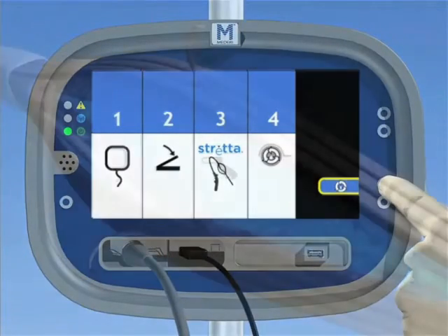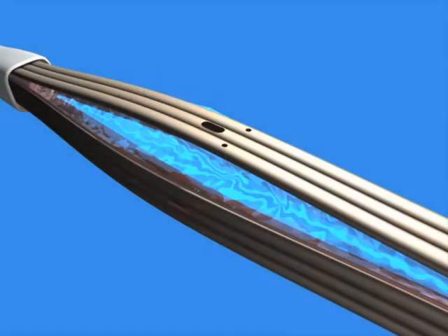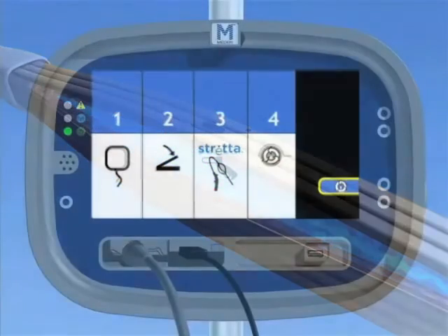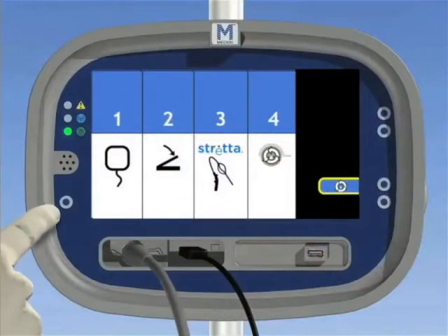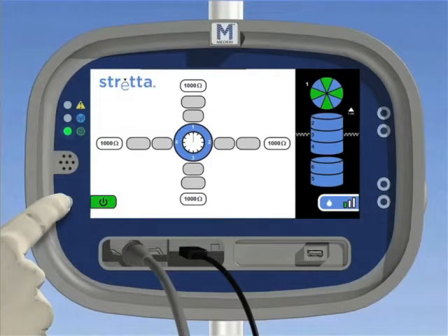14. Retract the needles on the catheter and deflate the balloon. 15. Always make sure the needles are retracted and the balloon is deflated before insertion into the patient and before moving the catheter during the procedure. Push the power on mode button to advance to the standby mode. 16. Note that the generator will not allow progression to the standby mode without priming first. After patient preparation and prior to first treatment, push the power on mode button again to progress to the ready mode.